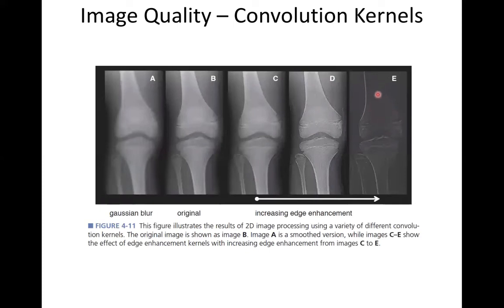It basically doesn't detect a derivative here. This goes to 0, and the only thing detected is the edge. And so this is straight up edge enhancement. These tend to be quite noisy, these images. These tend to be less noisy in terms of characterizing the noise as just random signal.